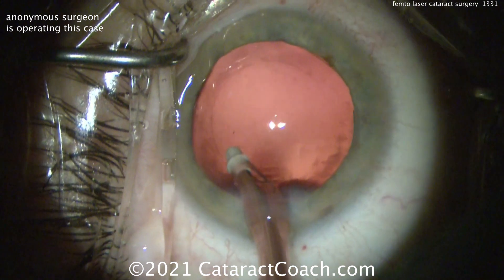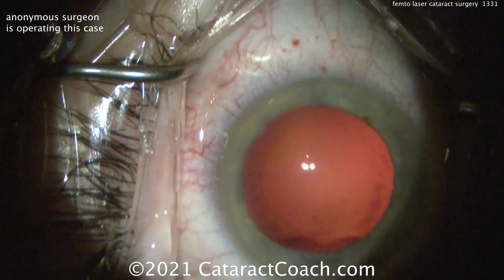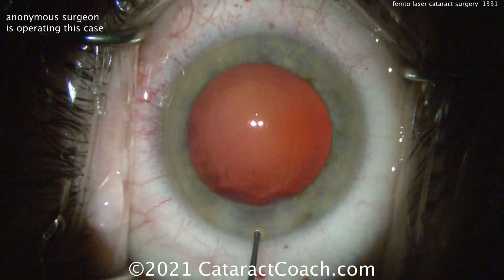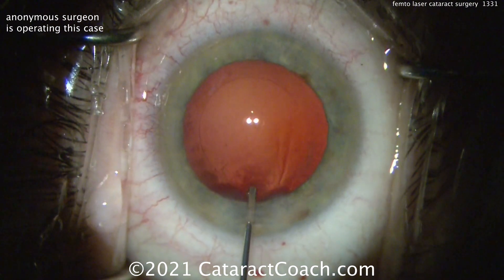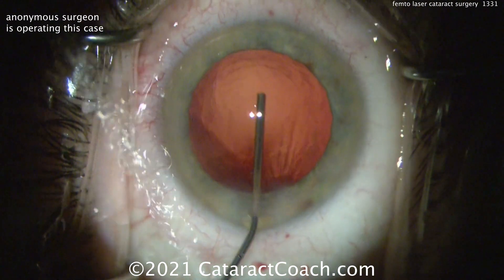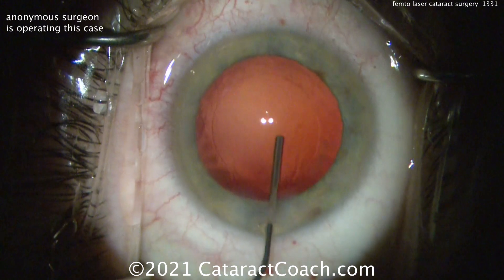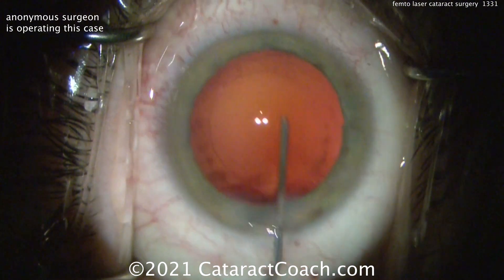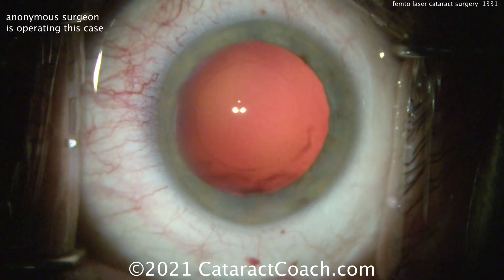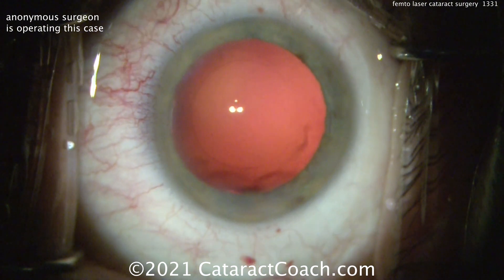So yeah, we have femtosecond lasers in our surgery center — we've had them for now more than 10 years — and we even have a choice of a few different femtosecond lasers, so you can choose which one you like. But remember, it's not going to replace the surgeon's hands. And we've seen now — you've heard from my videos — 10 years later, it's not that big of a deal. In fact, the refractive outcomes: there are no differences.